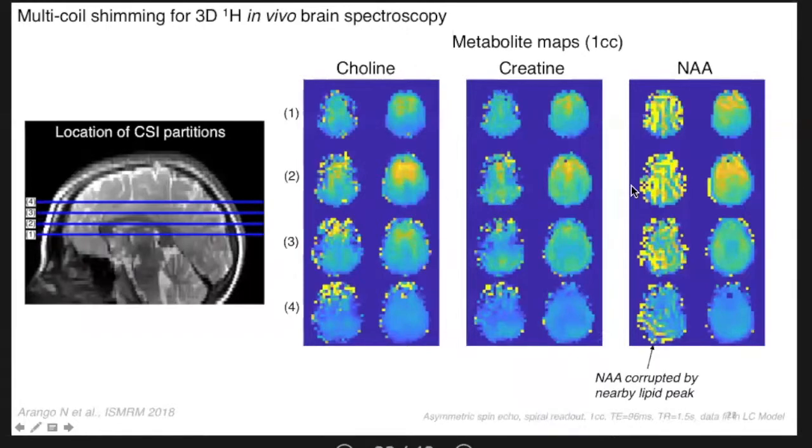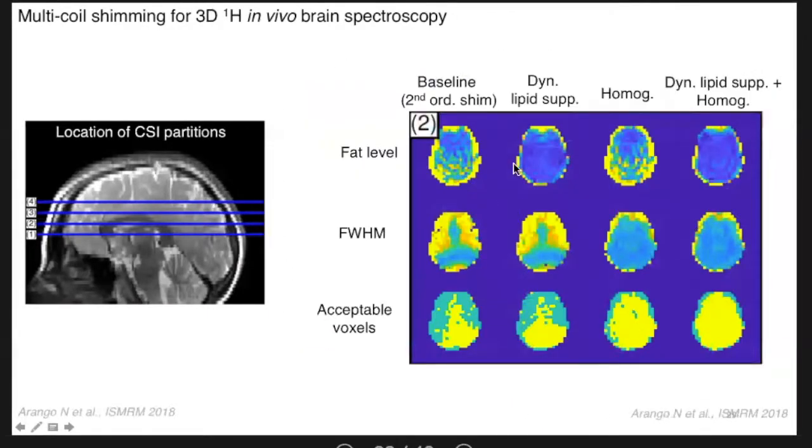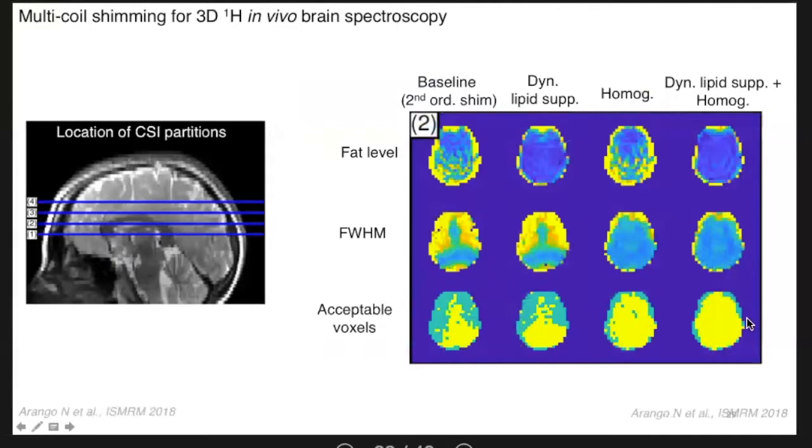And actually, when you look at the metabolite maps for choline, creatine, and NAA, we're seeing pretty nice improvements over the baseline case where you still had residual lipids that were contaminating your spectra and making it hard to quantify the metabolites, especially the NAA that's spectrally close to the lipids. And this just shows that the fat level in each voxel is going down, especially away from the skull. Also, the homogeneity shimming helps a little bit with the full width half max. It gives you cleaner spectra. So overall, if you quantify this as how many acceptable voxels are there in the volume, we're able to recover not every voxel, but we're able to recover a lot of these bad voxels that are in teal in this plot. So this was cool.